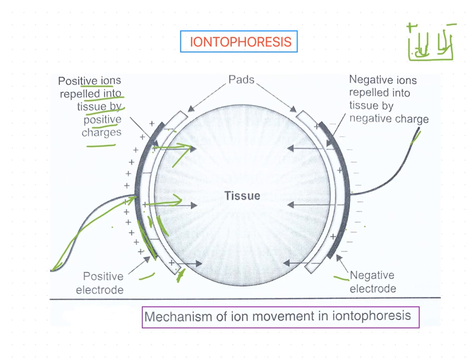On the other side, the negative electrode, which has negative charges, repels the negative ions into the tissue.